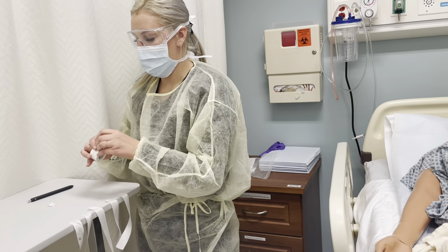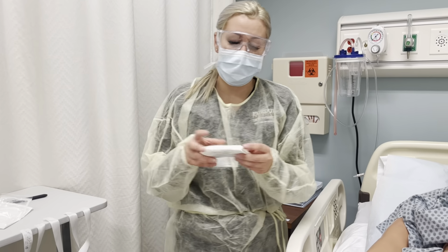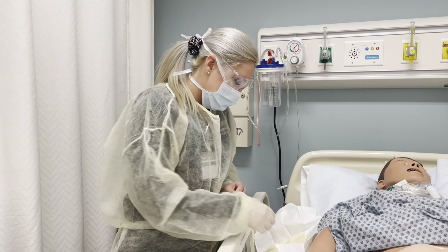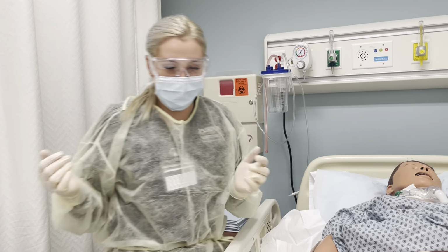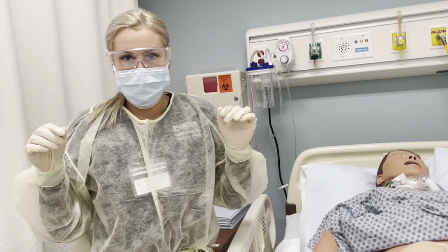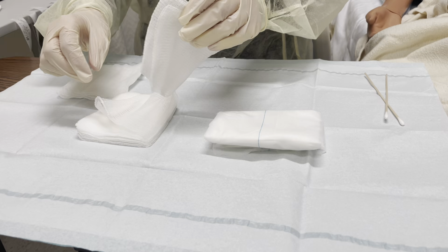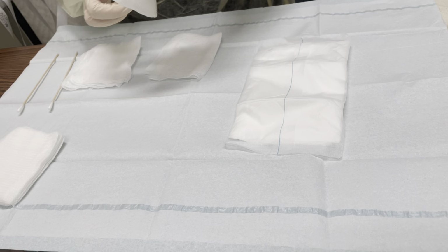Okay, and having that set to the side, I'm going to dog ear my tape for later use. And now I'm going to apply my sterile gloves, making sure not to turn my back to my sterile field or the wound, while still maintaining sterility. All right, putting on my dominant hand first. Okay, and maintaining. I'm now going to throw this away. Maintaining sterility. I'm going to set up my sterile field, making sure the blue line is up. Okay.